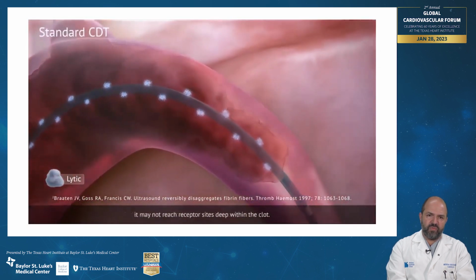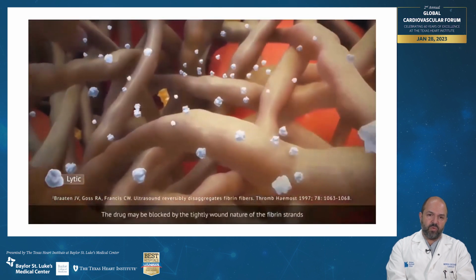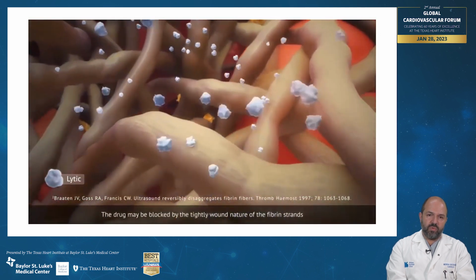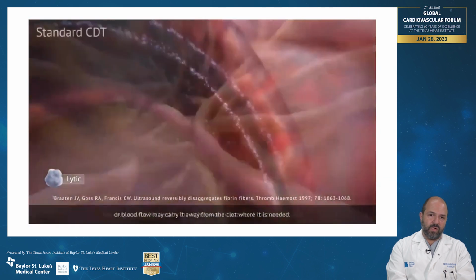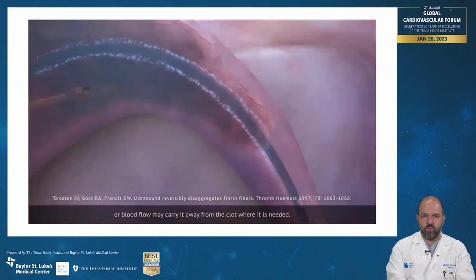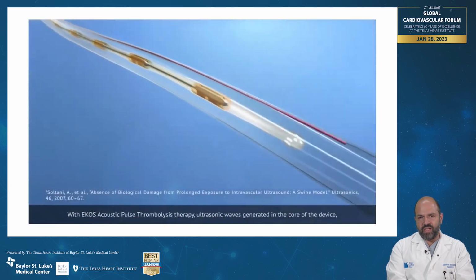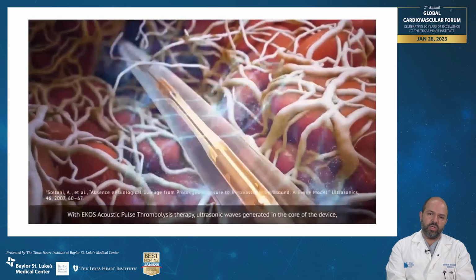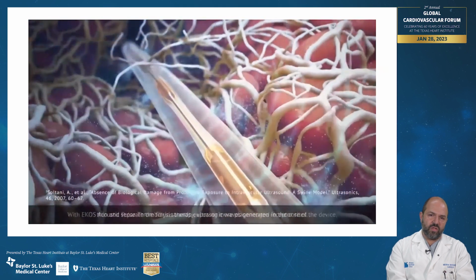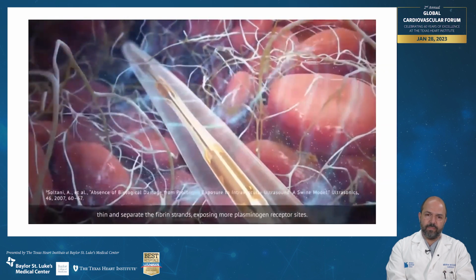And through multiple fenestrations in the catheter, TPA, thrombolytics are slowly dripped continuously. For PEs, we sometimes leave these in for 6, 12, even 24 hours. For arterial occlusions, because of the dense nature of it and the length, you can leave it in for 24, 48 hours on average. We decided to leave his in for a little bit longer than that.